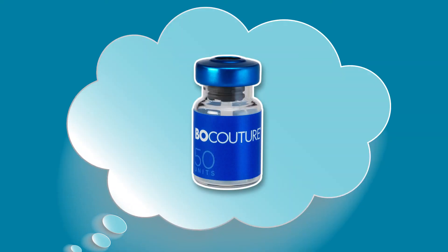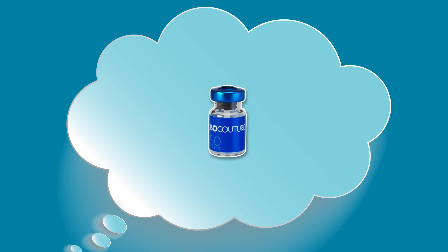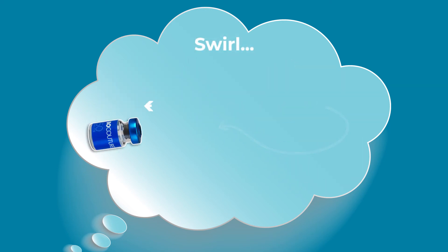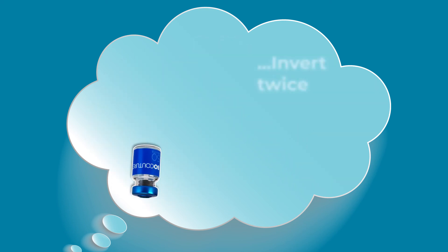Remember, if the vial is not inverted following reconstitution, less than 100% of the available BocaTure may be reconstituted, which could result in diminished efficacy upon injection. Therefore, swirl for several seconds in a figure of 8 pattern and always invert twice.